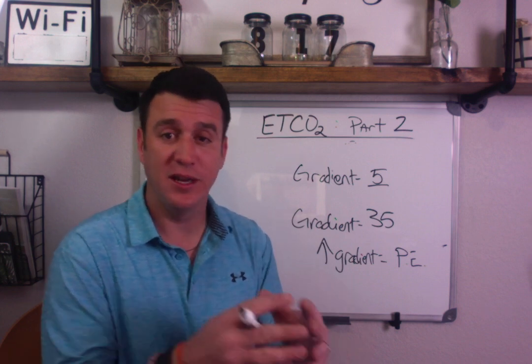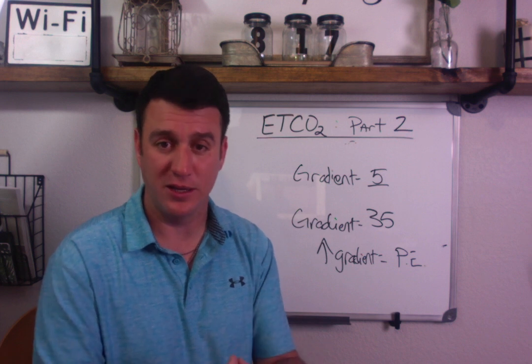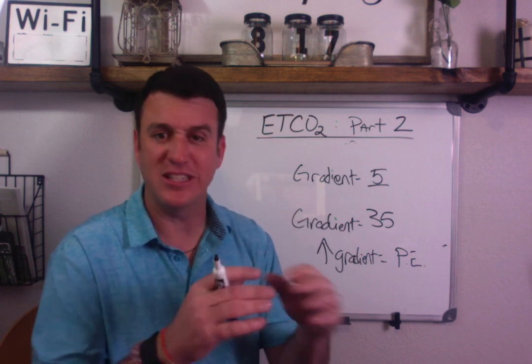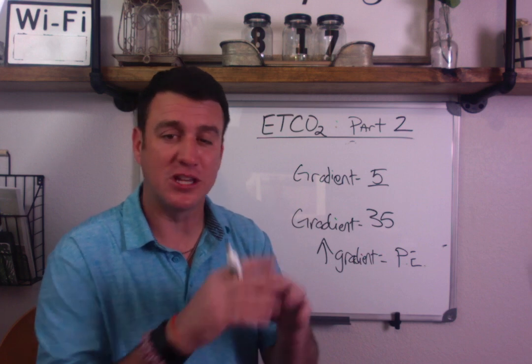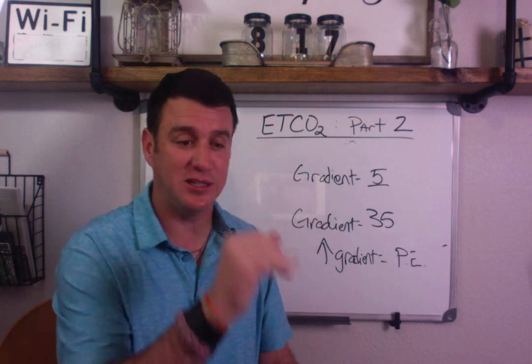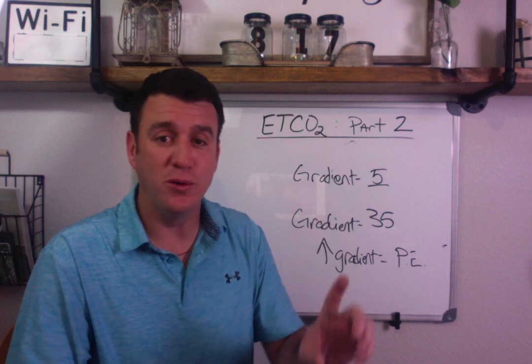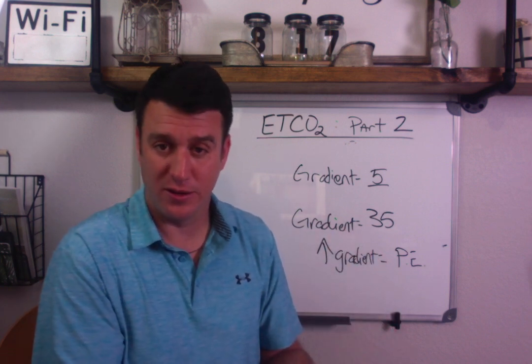So when you're doing compressions on a patient that's coding, and you have end-tidal CO2 monitoring present, and your end-tidal CO2 is 20, 20, 20, 20. But the longer you go, it starts to drop: 18, 17, 16, 14, 13. You need to understand that the person doing the compressions is getting tired.